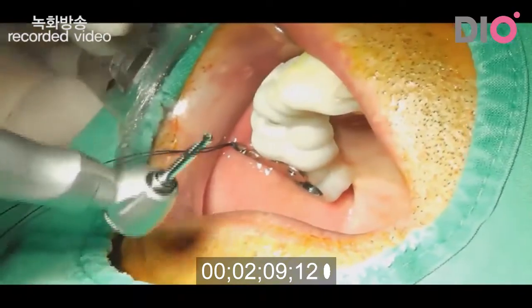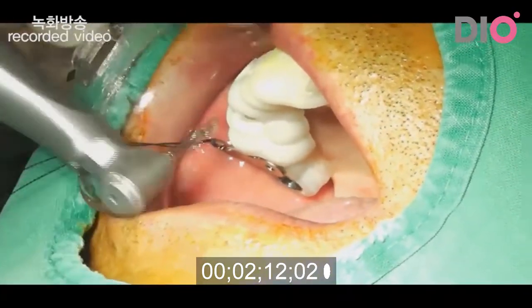This is the 2.0 drill. This is the initial drill. It has a stopper. And then I will drill.